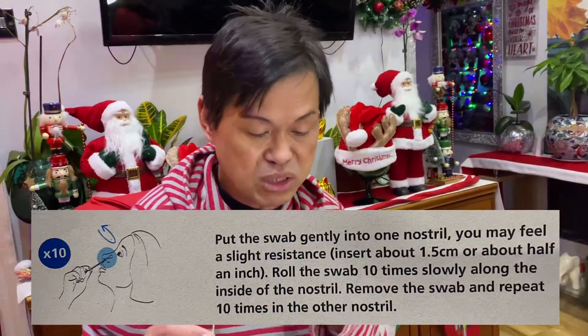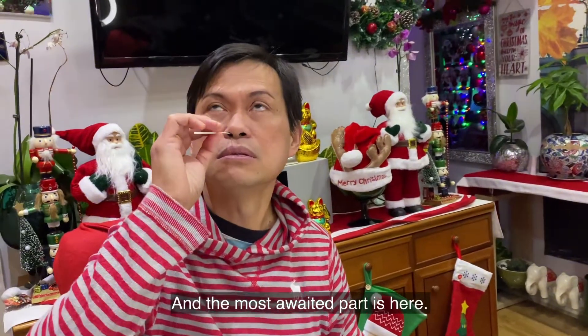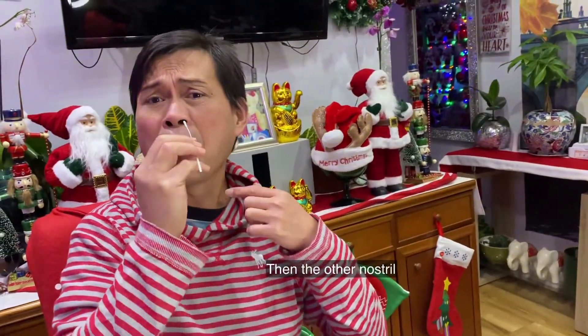Put the swab into one of your nostrils until you feel a slight resistance, insert about one point five centimeters or about half an inch, and roll the swab ten times. You need to roll it ten times. This is a bit painful and irritating, but it's necessary. Then do the other nostril as well.